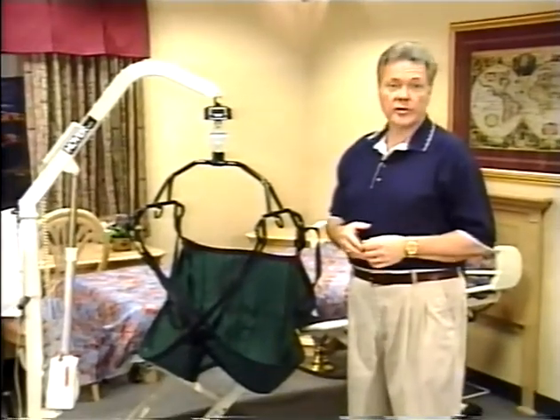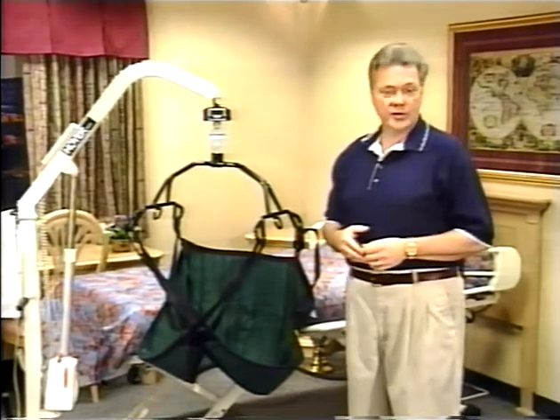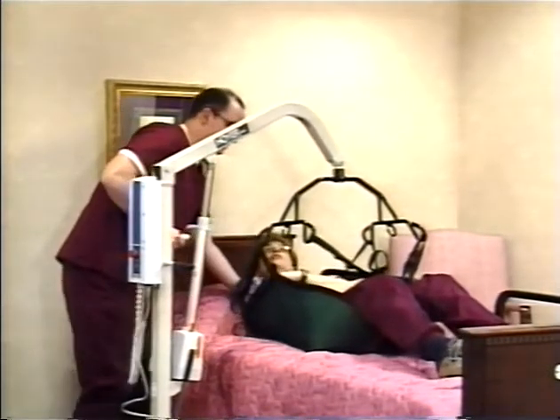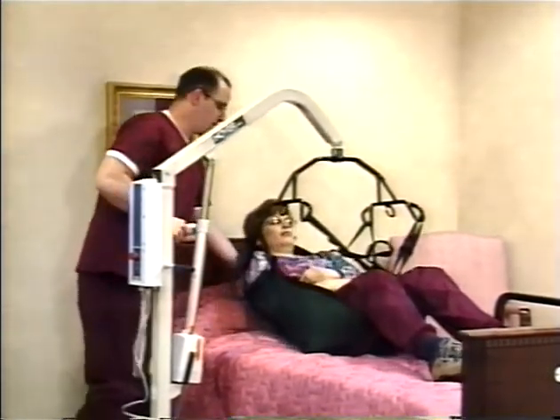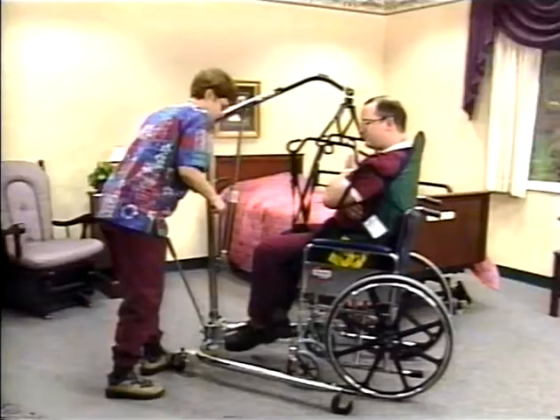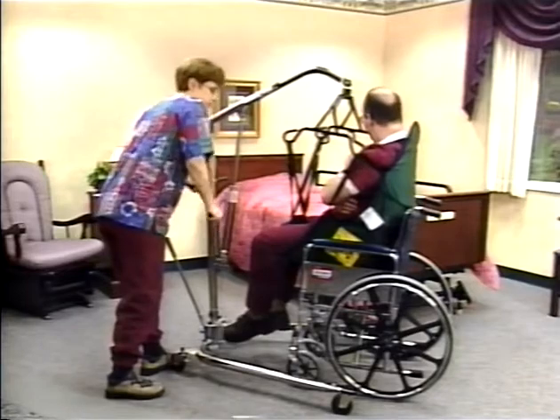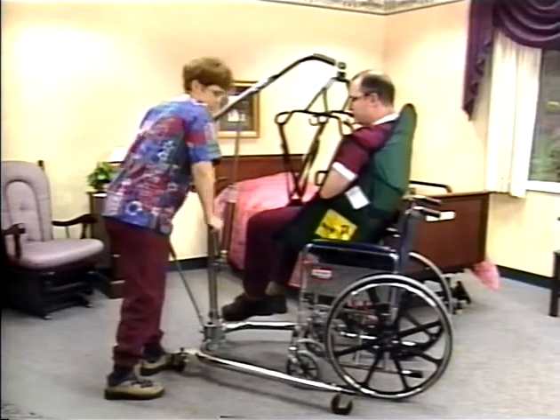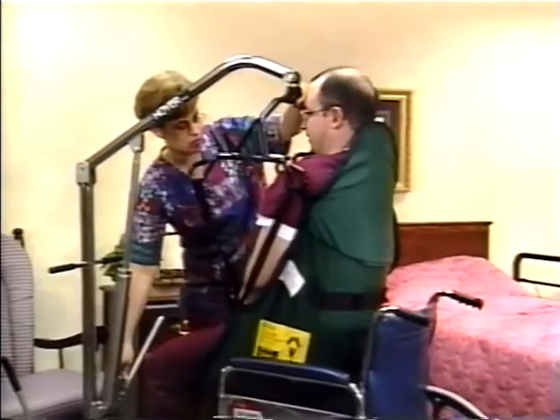During our program, we've discussed the importance of knowing and using proper techniques to safely and effectively use your Hoyer lifter. Now you're familiar with the basic components of your lifter, and you've learned to evaluate both the lifting environment and your resident's needs. You've also learned to safely lift and transfer in a variety of situations. After watching this program, it's recommended that you practice lifting with the help of other caregivers. Each of you should be familiar with every aspect of the lift process, as the observer, the operator, and as the passenger. The better you understand the dynamics of lifting, the better you'll be able to perform your task in a manner that is safe and comfortable for both you and the people in your care.